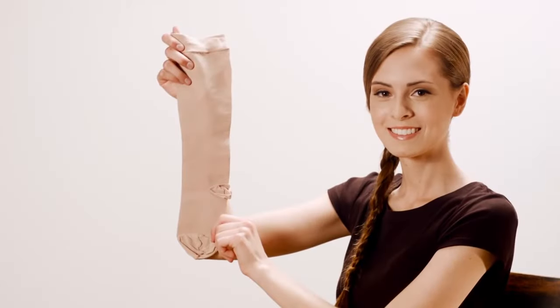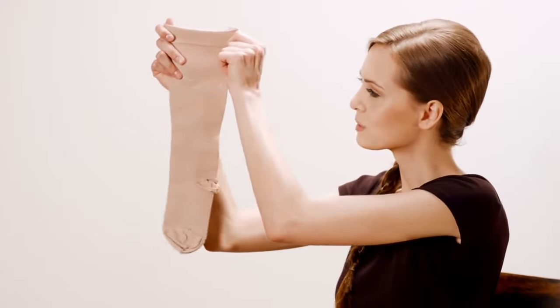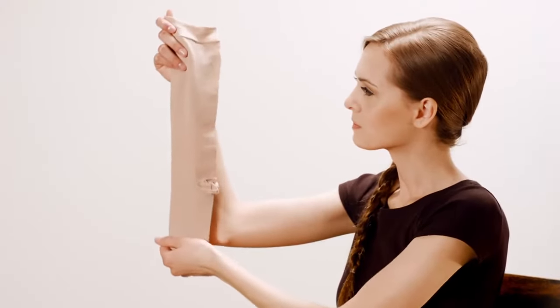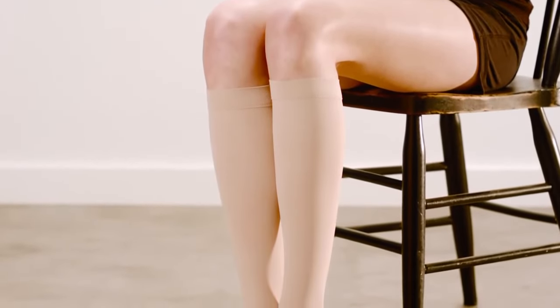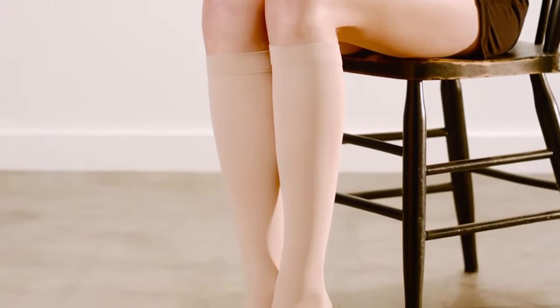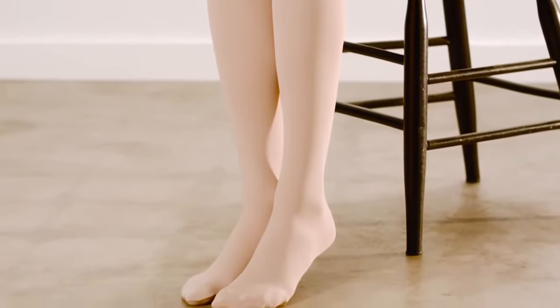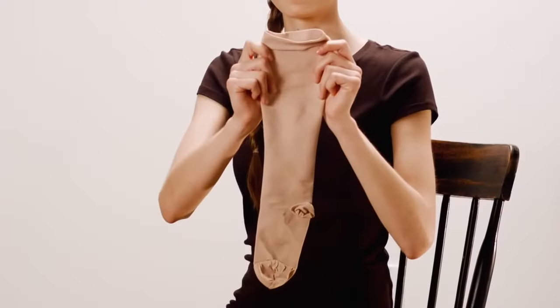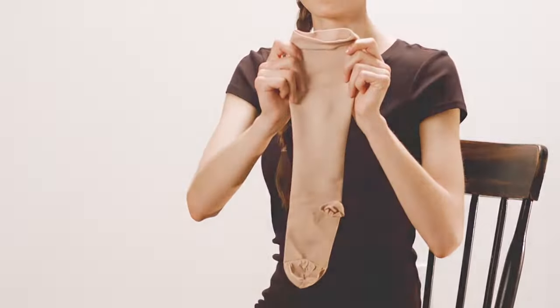Compression hosiery has more resistance or compression than traditional pantyhose and therefore requires a special technique to don. Many believe that bunching is the easiest way to get the product on, however this bunches all the compression making it almost impossible to get on. If this is your first time donning compression hosiery, know that they will be a bit more snug than traditional hosiery. And now we're ready to show you how to don your compression hosiery with ease.